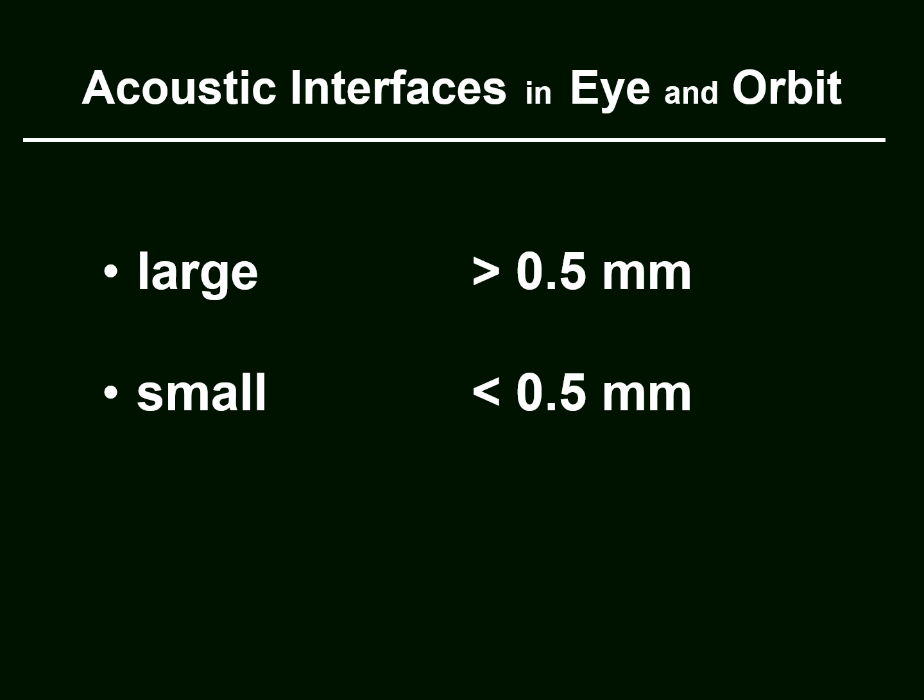Large acoustic interfaces are those with a diameter of greater than half a millimeter. Small acoustic interfaces are those which are smaller than half a millimeter.